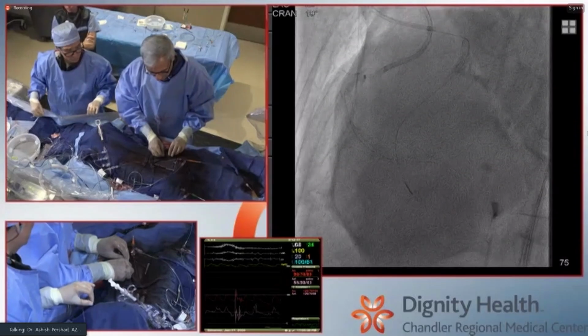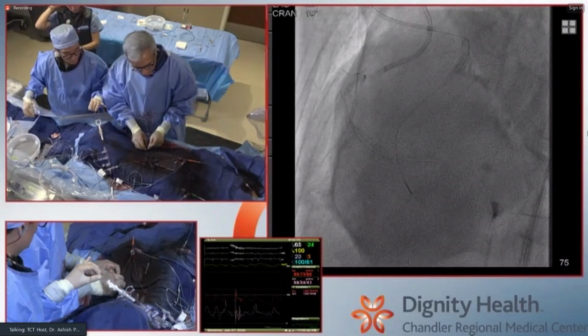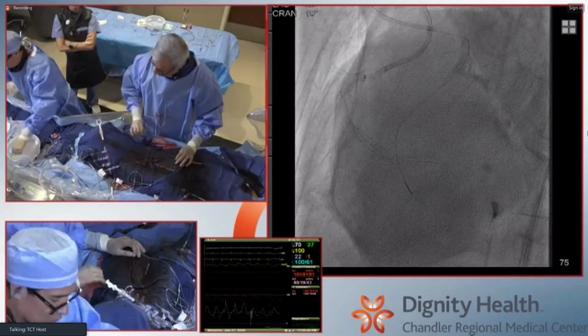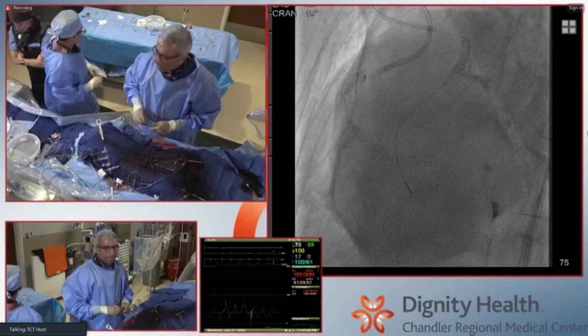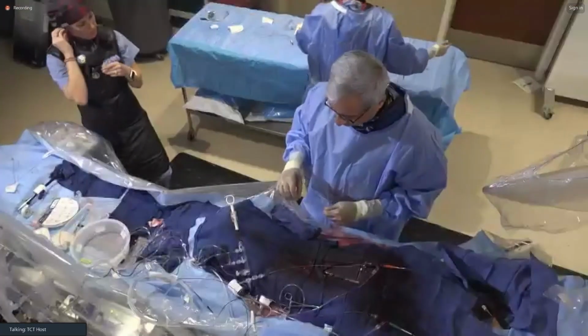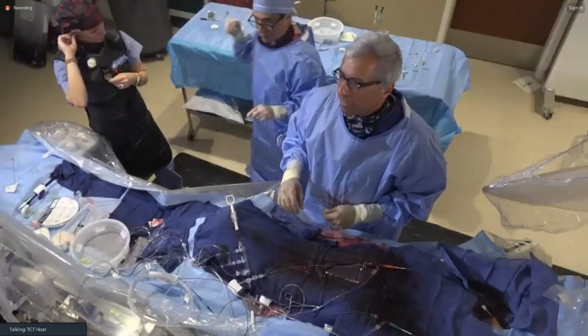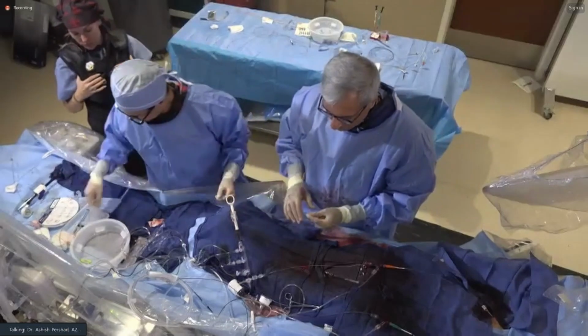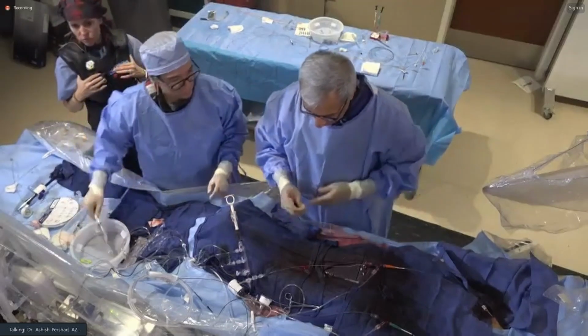I don't know if this is a hematoma. This is a dissection. I agree. I think that was probably in and out from those wires, and you have exit points within the true lumen. So this is one of those things where if you gently balloon it, release whatever's in there, you stent over it, you're done. Going up with our balloon here to just get my guideliner back in.